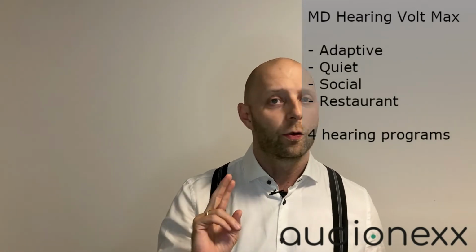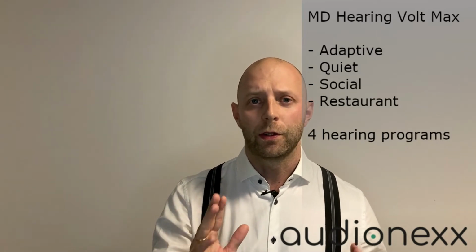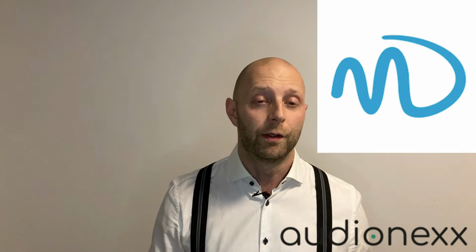The Volt Max has 4 hearing programs: adaptive, which is intended as an all-around program, quiet, social, which focuses on conversations, and restaurant. Before using the hearing aids, I strongly recommend creating a personal profile in the smartphone app, which allows the hearing aids to adapt the hearing programs to your needs. The creation of the personal profile is what hearing aids do in in-situ audiometry, where your hearing gets tested with sounds over the hearing aids. It's not the gold standard, but it works pretty well. So this is important to adjust the Volt Max to your needs.